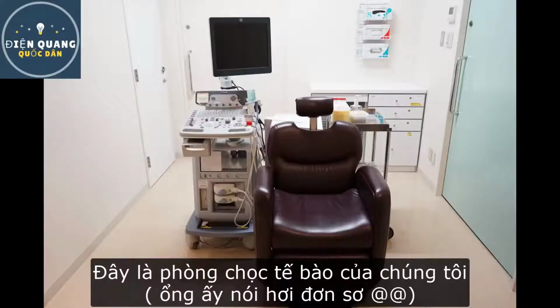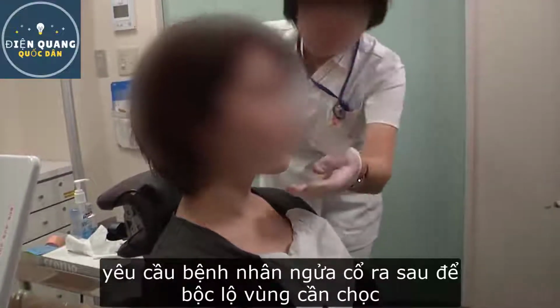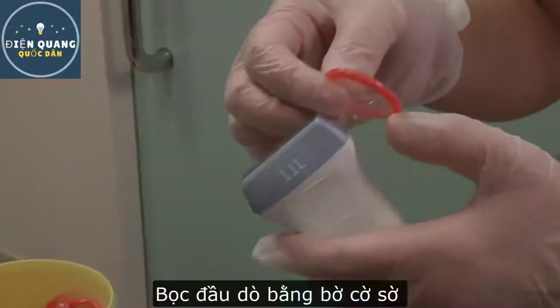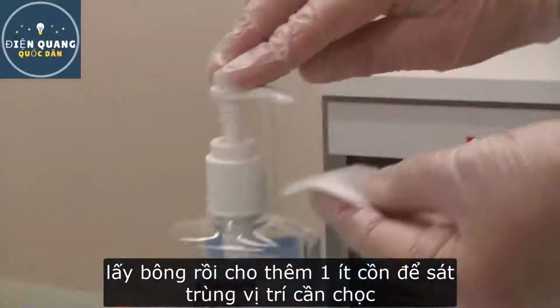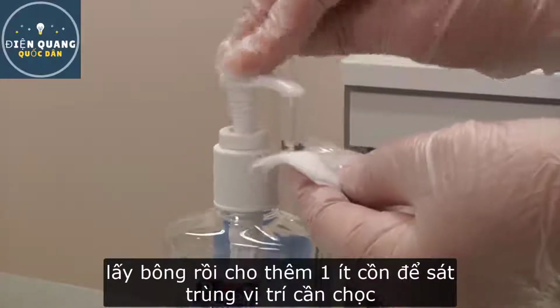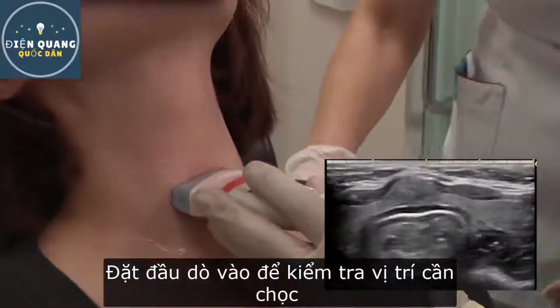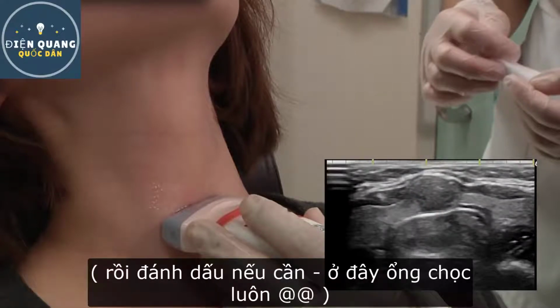This is our aspiration room, where the patient undergoes aspiration cytology examinations while sitting on a barber chair. We ask the patient to look up at the ceiling. By keeping this posture, the thyroid mass is stabilized. The probe is covered with a condom. Abundant gelatinous antibacterial agent is used as ultrasound jelly. Afterwards, explore the area by moving the ultrasound probe to detect the thyroid nodule and press it using the probe.